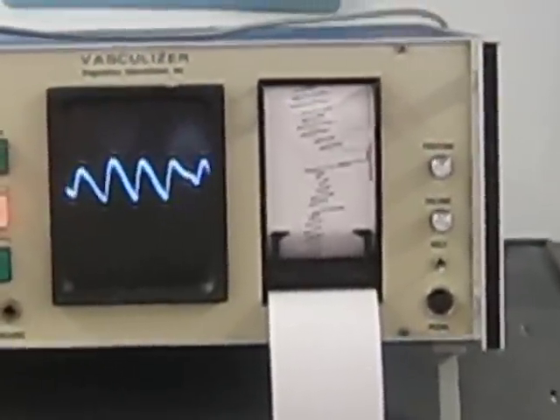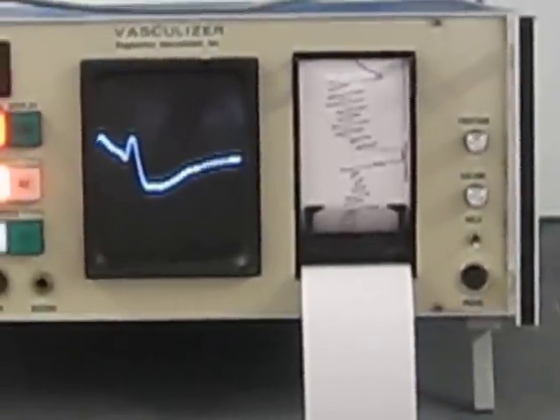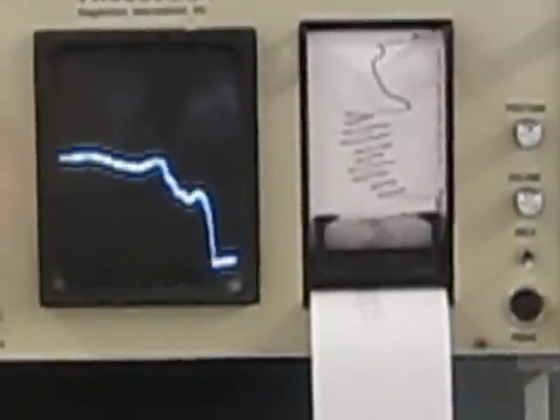Now elevate your hand above your head. Thank you. You notice the first thing here is that there's a diminishment in the wave height and there's almost no pulsation there.